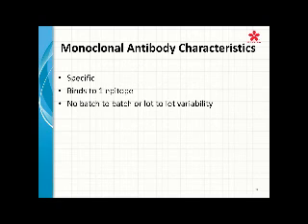Polyclonal is definitely more sensitive, and you'll find that polyclonal antibodies are used for your harder to detect antigens. An example would be TDT in a laboratory. Generally, your TDT is a polyclonal antibody. It's more sensitive, so it's going to pick up that TDT antigen within the tissue. And monoclonal is going to be more specific, so it's usually used for your general immunohistochemistry stains within the laboratory.